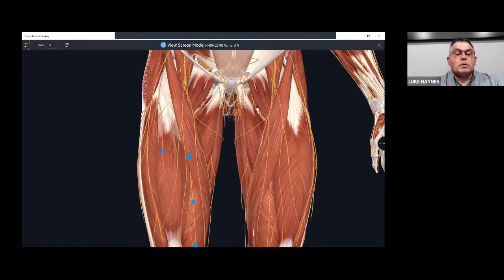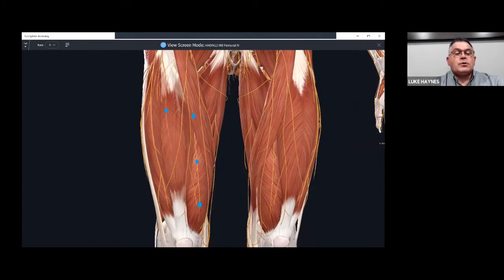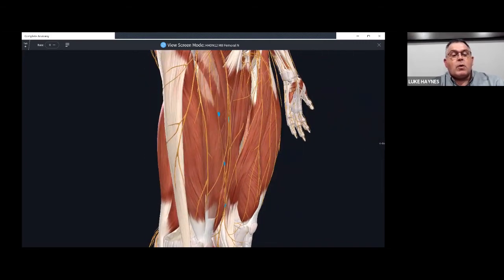Again, what we'll do is first needle just directly into rec fem. Vastus intermedius will come just slightly lateral to the bisection or the merger, the demarcation between rec fem and vastus medialis. We're going to take our needling location into the VMO itself here, and then we're going to put one right in between these two spots as well. Absolutely. Let's complete the quads by coming out.